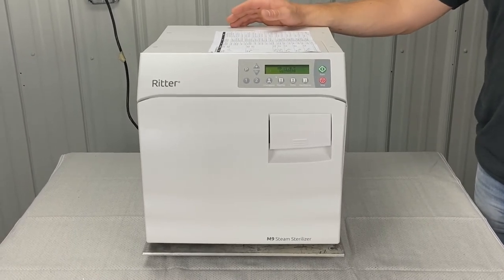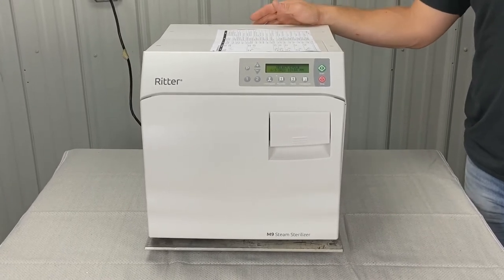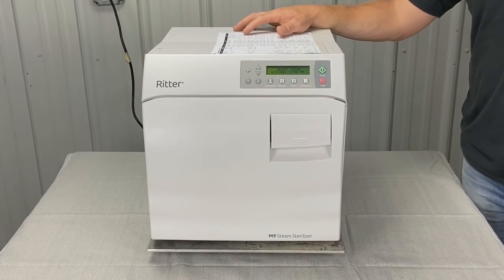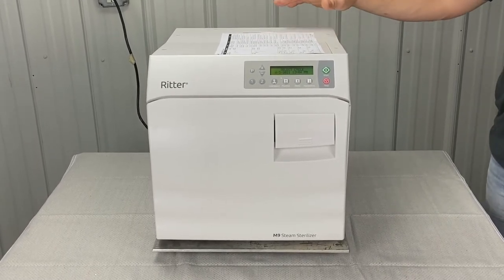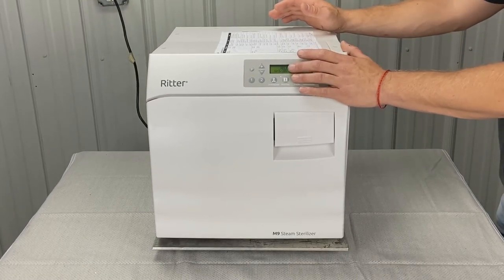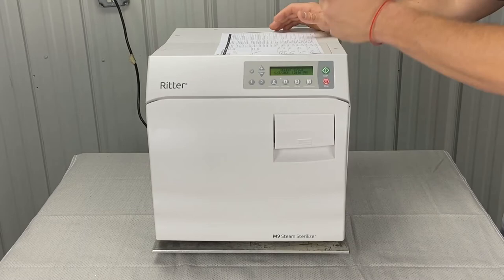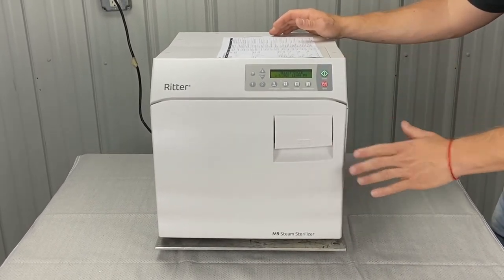Power interruption could be due to an electrical storm, brownout, etc. You're going to secure the power cord connections at the wall outlet and double check those like we just talked about. Unplug the unit for 60 seconds, then plug the unit into a dedicated, properly rated circuit. After you've done that, the error code should go away. You might want to wait for the unit to cool down, pull all the instruments out, and run an empty cycle — that's what we always recommend.